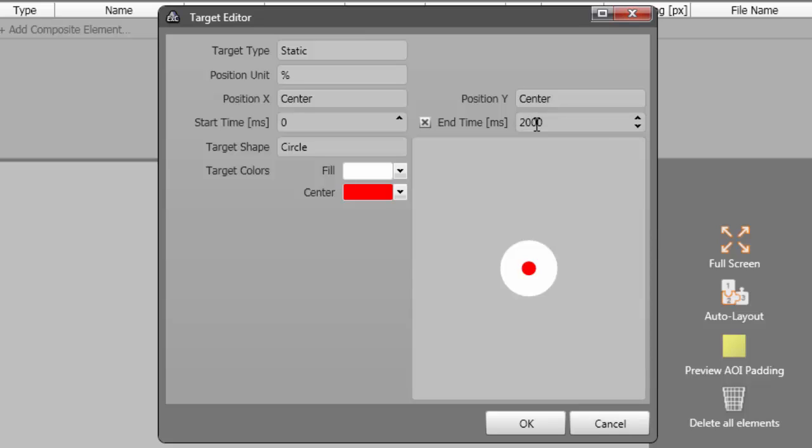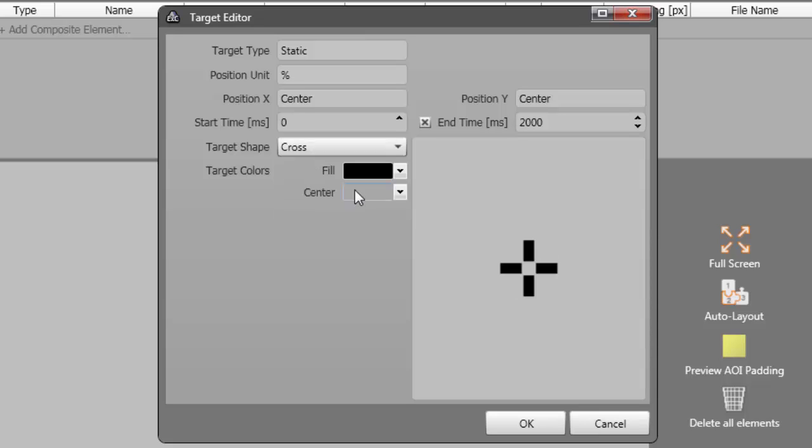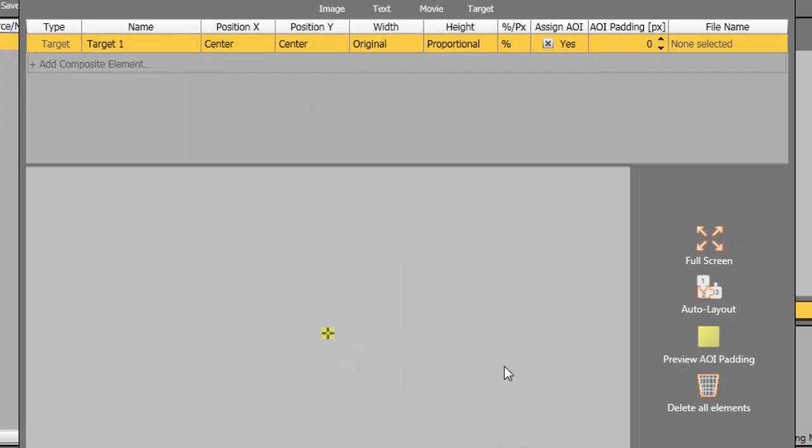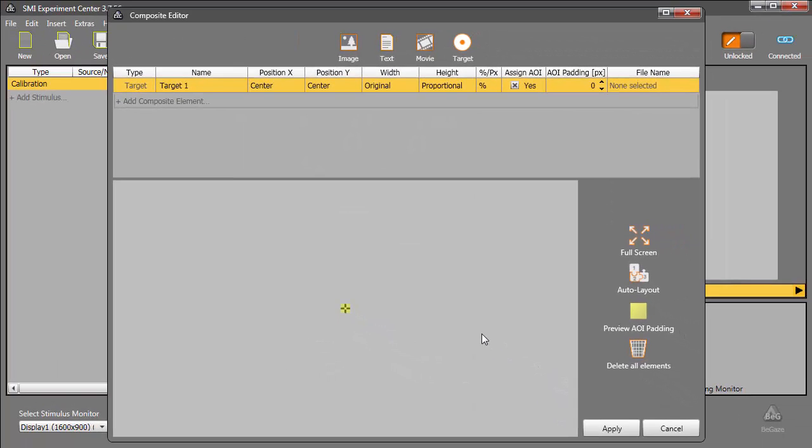Next, we'll specify the target shape. From the available options, I'll choose Cross. A custom target can be created from any bitmap, PNG, or JPEG file. You can also modify the colors for the built-in shapes if desired. The defaults work for me. Now, we click OK to save our changes.